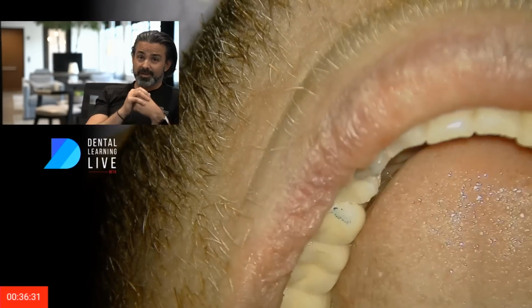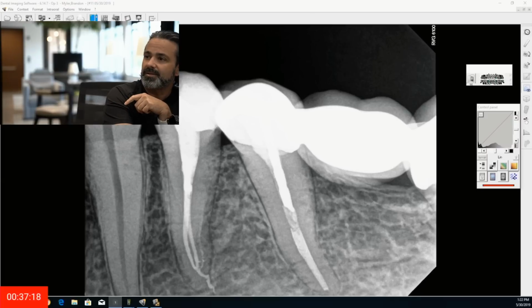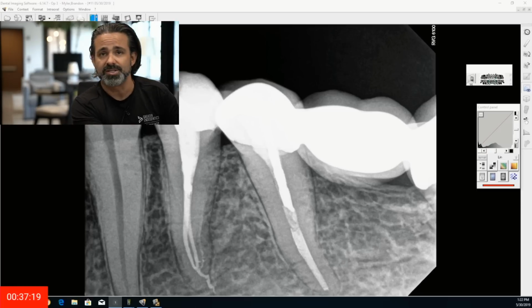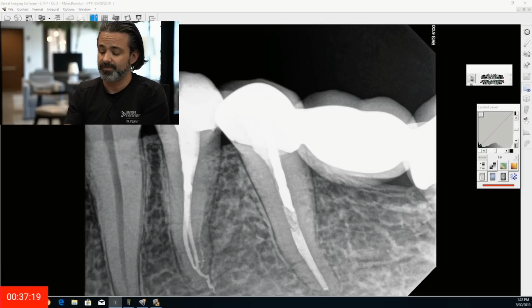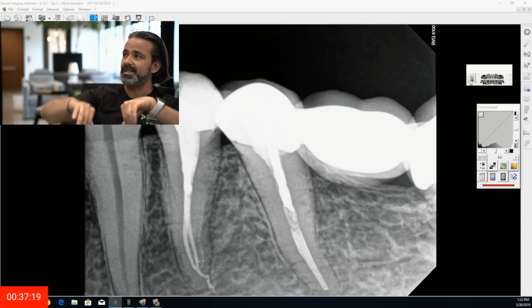And I know you guys are all masters and mavens out there, but you can see that I've closed those margins. And I'm going to pause this here because I want to talk about this a bit. What's interesting about it, so again, I've closed these margins and that's really useful. I mean, really useful. And then you can see where I've taken that Munce spur down to about this level, and there was sort of a stone somewhere in here, and then I get into the fork. And I believe the GentleWave really opened this part up right here, and then it gets into the fork and the bend, and this is where it was really steep right here.